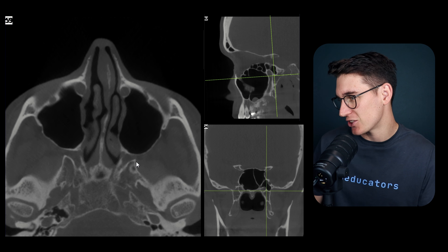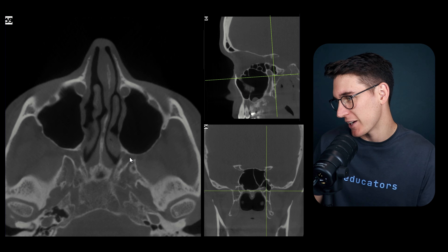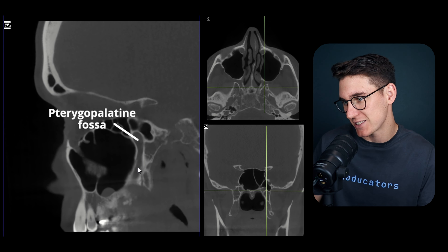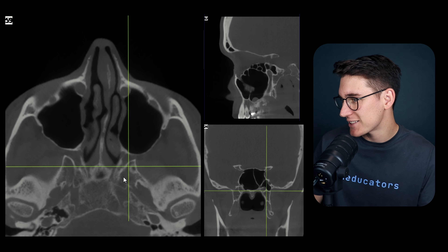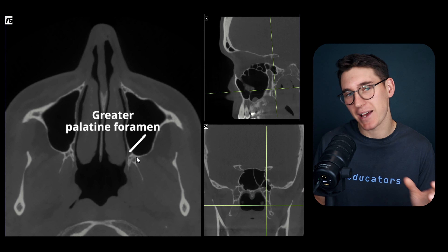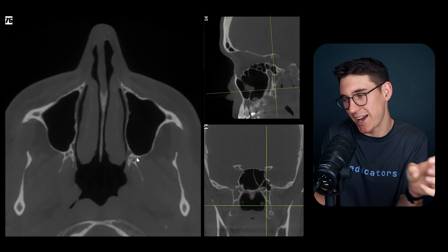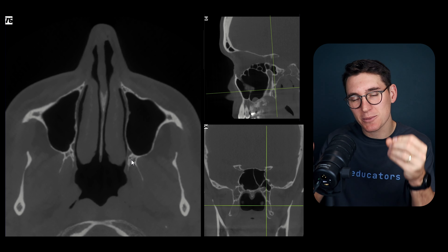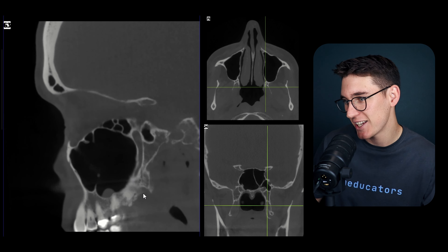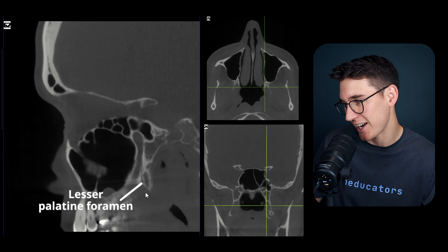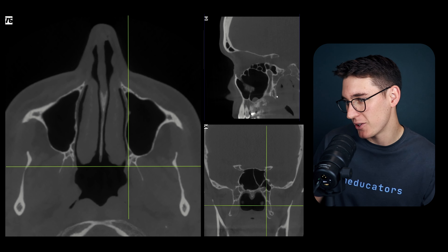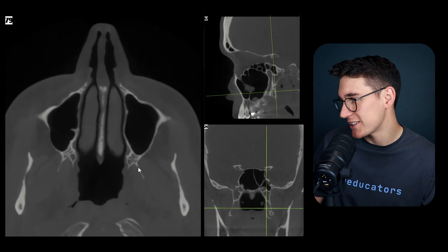These structures help identify the superior aspect of the pterygopalatine fossa. On our sagittal section we've cut through the pterygopalatine fossa, and heading down inferiorly we see two separate foramina: the greater and lesser palatine foramina. The greater palatine foramen is normally more anterior and more lateral; the lesser is posterior. These are the two exit points of the pterygopalatine fossa, also visible on our sagittal slice with the lesser palatine foramen laterally and the greater palatine foramen heading into the palatine bone.